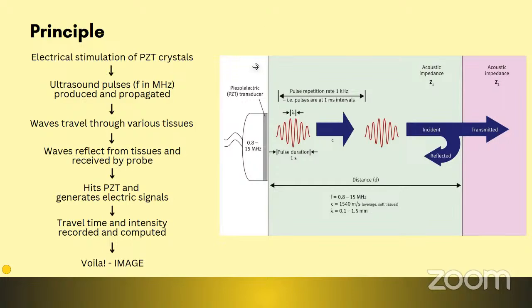Okay, Doppler, good try. EM waves, no. Electromagnetic waves are completely different. We are dealing with sound waves. That's why it's ultrasound, right? So the main working principle is basic. Yeah, sonar. Thank you very much. Sonar was the word I was looking for. So basically, we are going to use something like echolocation. Doppler is a derivative of echolocation.